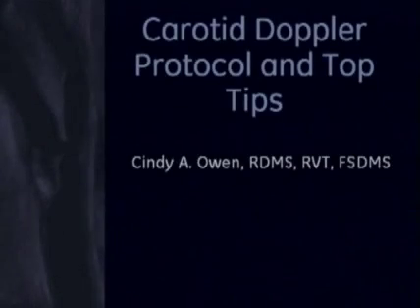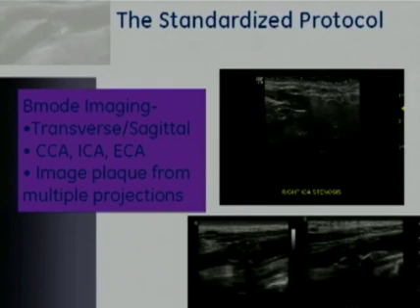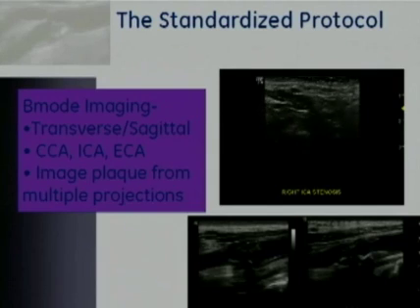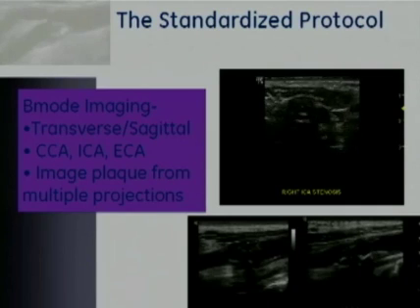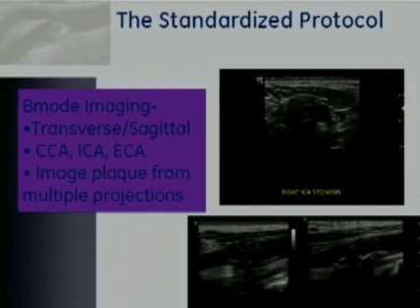I'm going to talk about Carotid Doppler protocol and some tips for performing the exam. What I'm going to start with is the standardized protocol. That's very important: within each lab performing carotid Doppler, you should have a protocol that is written down and can be followed by everyone in the laboratory. This will standardize the procedure and is very important for follow-up of patients.